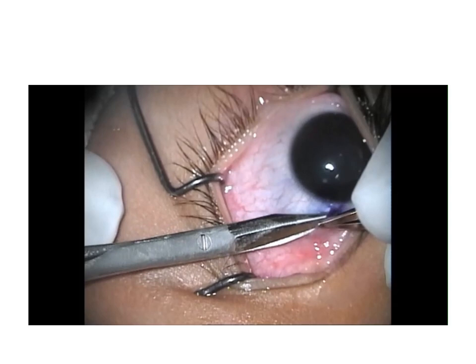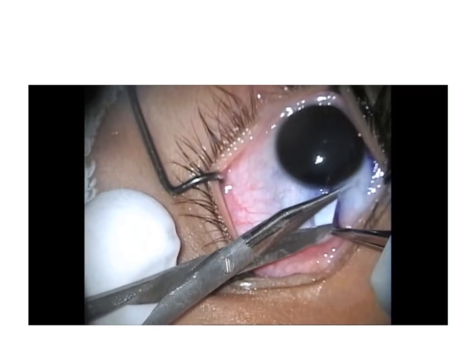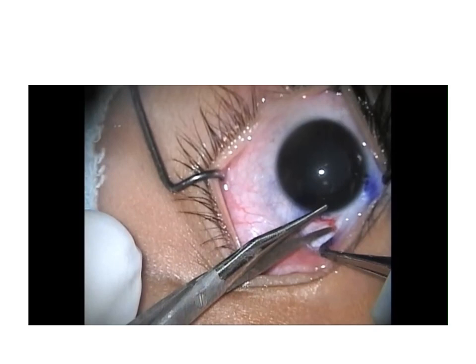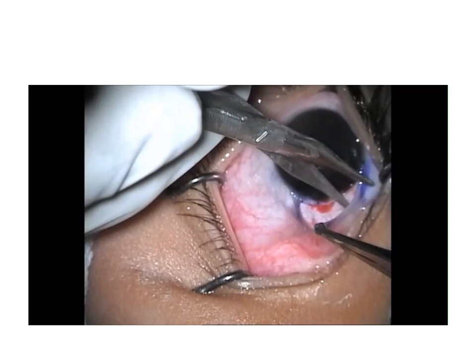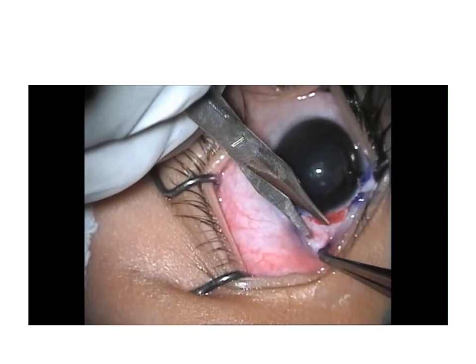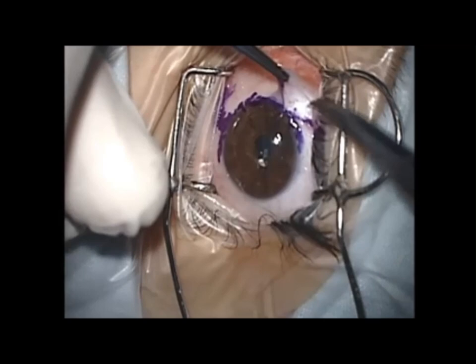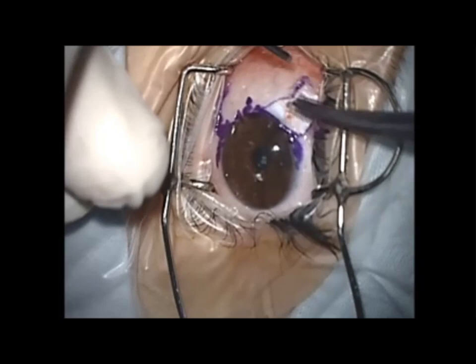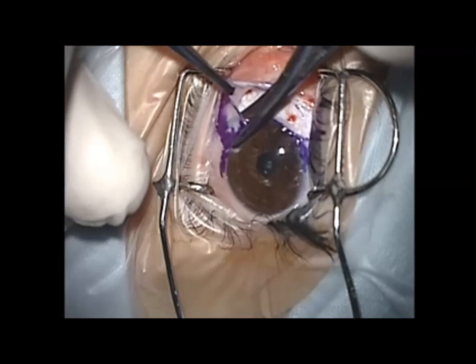The circumferential incision is usually accompanied with one or two radial incisions at the start and at the end of the incision to facilitate exposure. Usually only a short two or three millimeter radial extension is all that is needed. But in few instances when exposure of the very posterior part of the sclera is needed, such as in posterior sclera fixation or Faden sutures, the radial incisions are made longer to facilitate exposure and identification of the posterior part of the sclera.